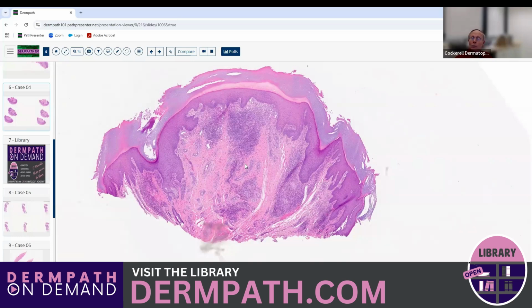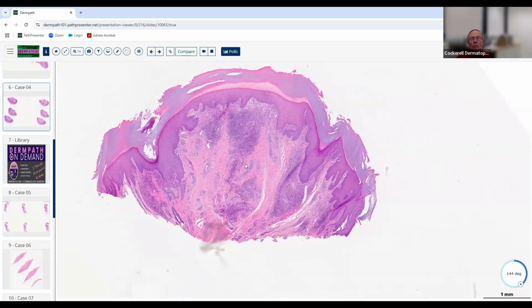And then what's the other setting, though, where you can see this? So there's certain diseases in dermatology and dermatopathology that we call histologic identical twins. For example, granuloma faciale and erythema elevatum diutinum, histologically those look very, very similar. Or bullous pemphigoid and pemphigoid gestationis, those look histologically the same. They're different diseases, with two different immunofluorescence patterns, but they histologically look the same. So this also has a histologic identical twin, but clinically it's a completely different scenario than just a few bumps on the head and neck area.